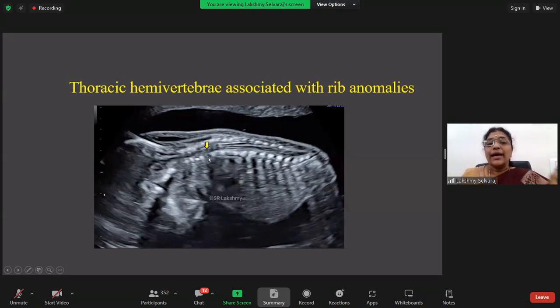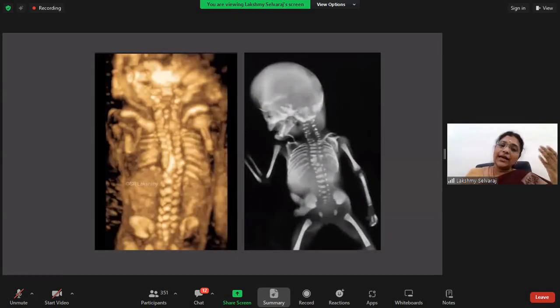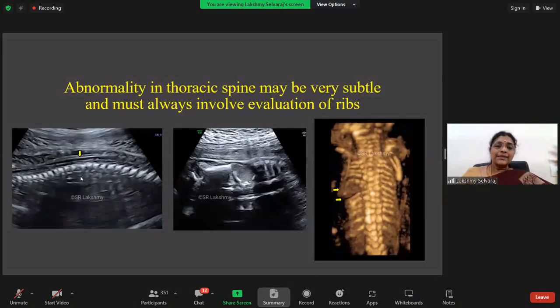So that is why evaluating the vertebral body and the intervertebral disc space is important. Look at the intervertebral disc space here. It's absolutely crowded, crumpled. Look at here, the lumbosacral region, it's looking fine. But here, the vertebrae are all looking bad. So this gives you a clue to identify further and go more. As I told you, this is again another case.